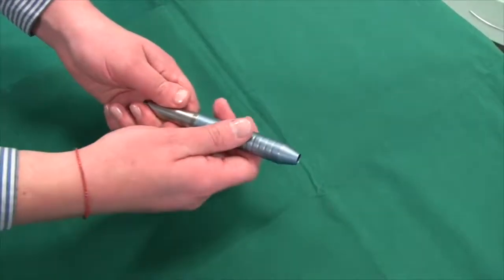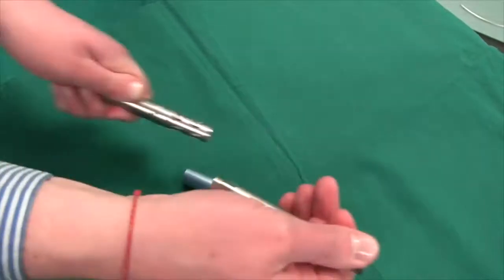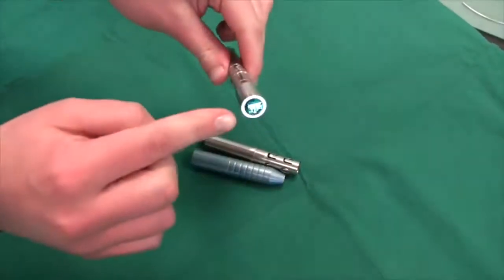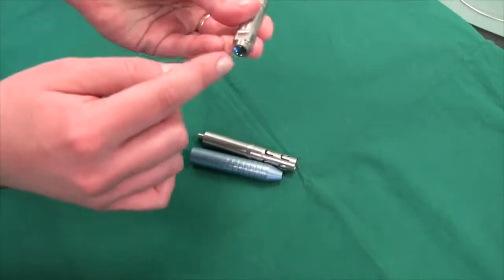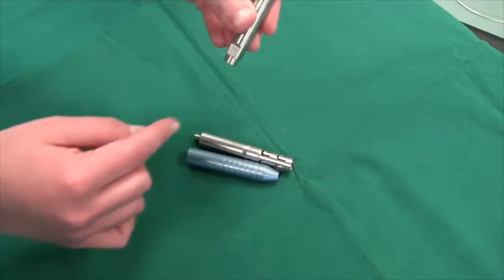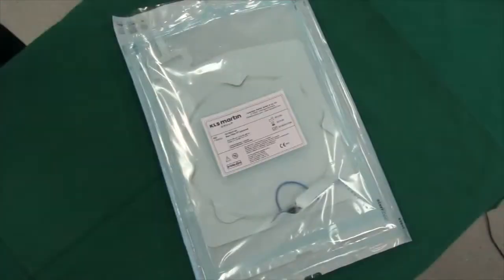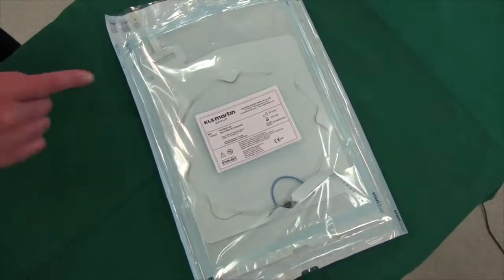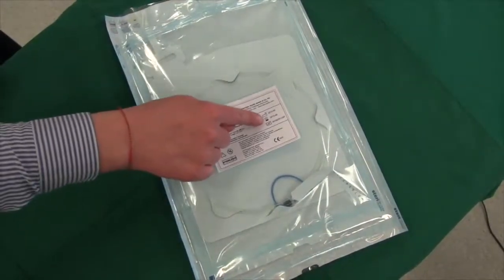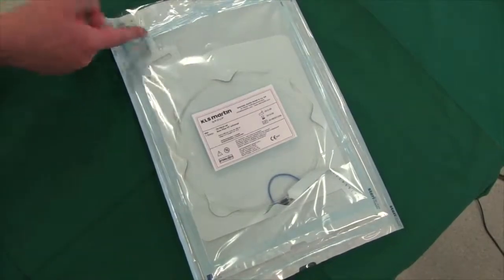Please also check the focusing handpiece. Its lens should also be clean and not display soft tissue or fluid residues. As for sterile packed fibers, please also check the expiry dates and if the packaging is in undamaged condition.